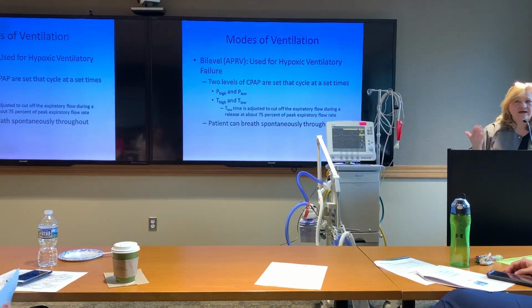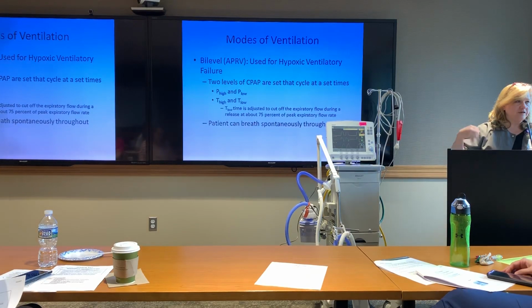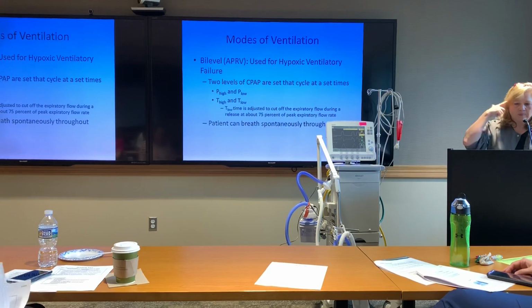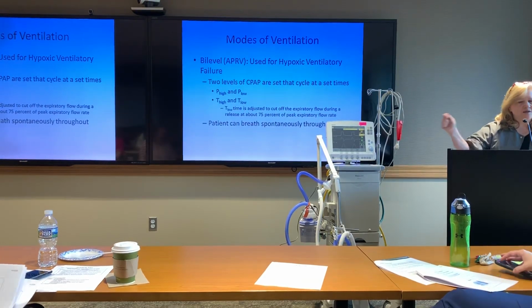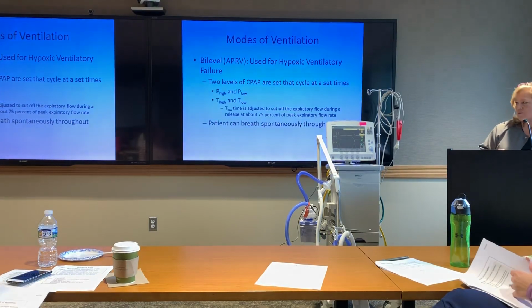Just kind of remember that 1 to 5 ratio, so you don't actually have to do the PF calculation if you don't want to. You just get a good impression for like, whoa, this guy should have a much higher PO2 than this. I'm not really concerned because it's 85, but do we need to do something more? Does that guy need maybe a little bit more PEEP instead of being on so much FiO2? So that kind of thing you can just think about. It's kind of like thinking about how much they are breathing to get that normal CO2. How much work is involved in that? Just things to remember.